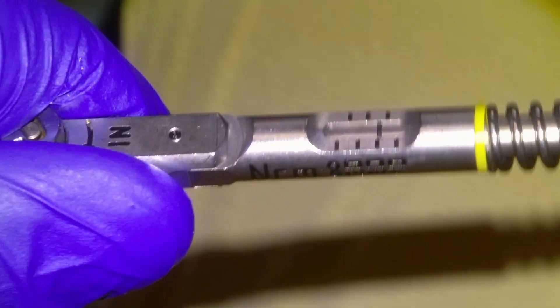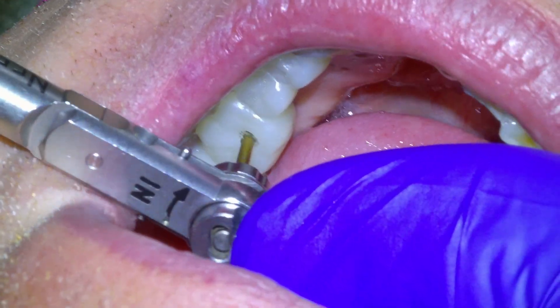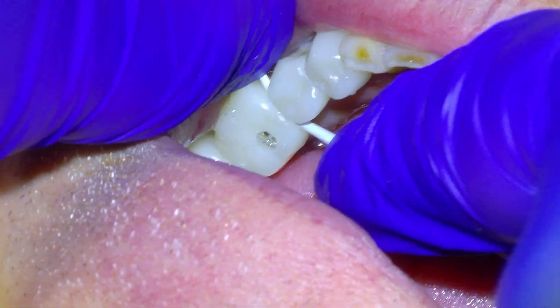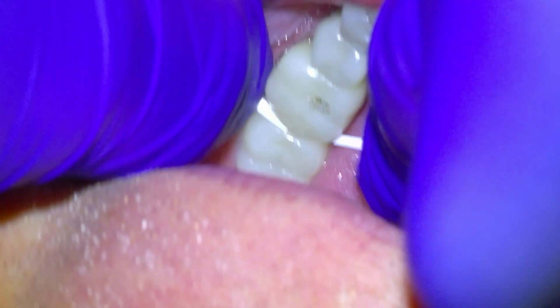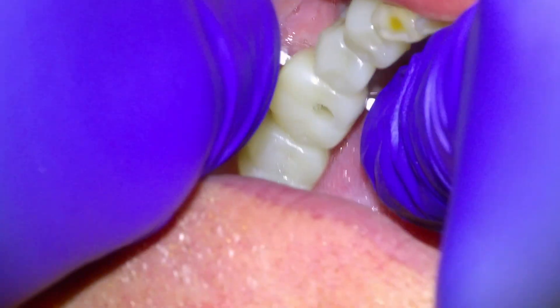Might pinch a little bit as it goes down all the way. Doing okay so far? Yep. That's good. Feel a little bit tight in there. Yeah, that's about good for floss tightness. I'll check the bite here.